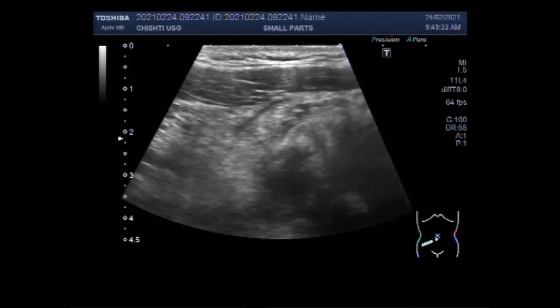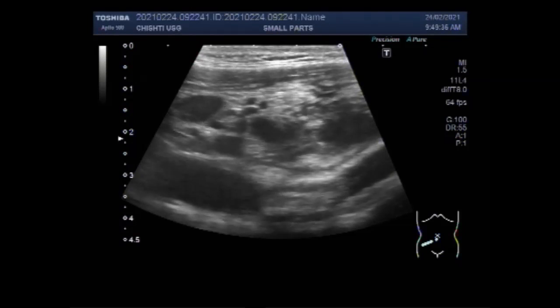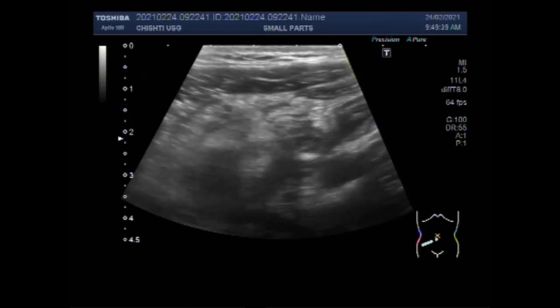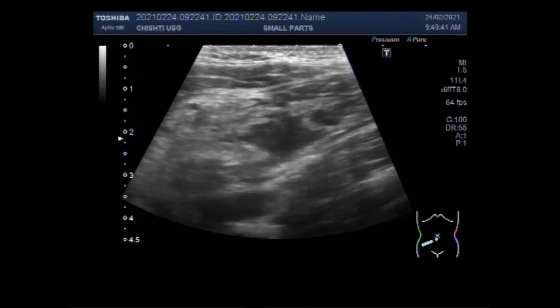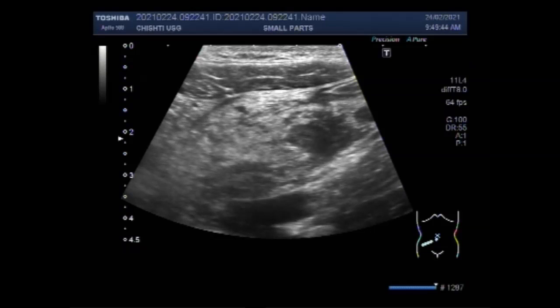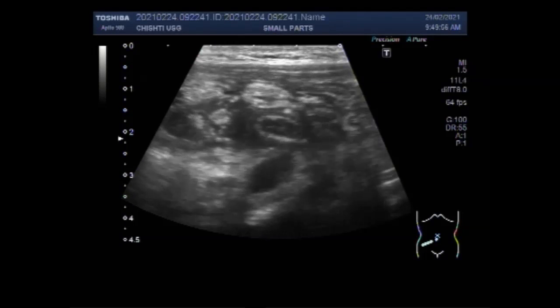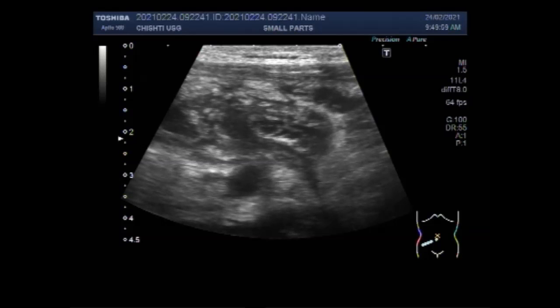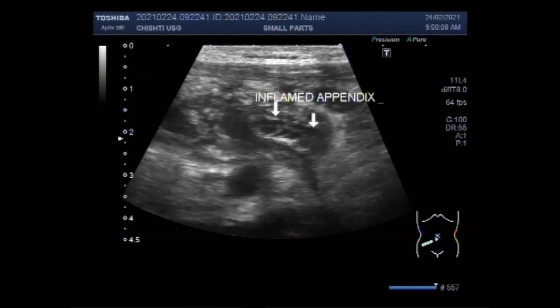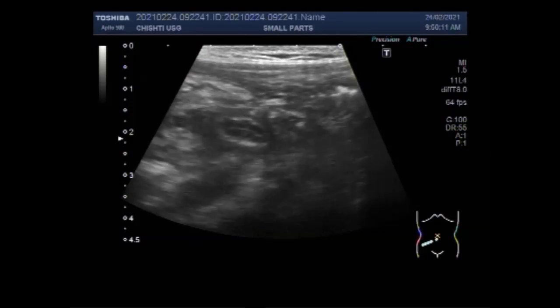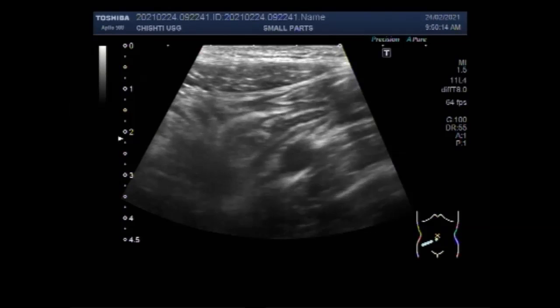Now again you can see the lower portion of the ascending colon near the cecum. This is the appendix. The size of the appendix is small as it has ruptured and the fluid has gone outside its body.